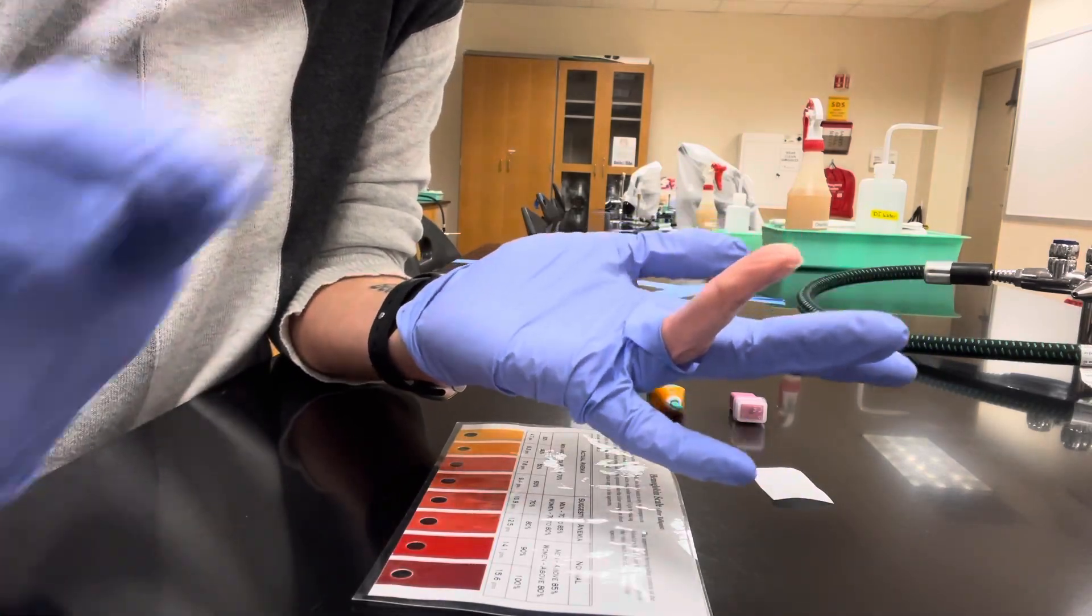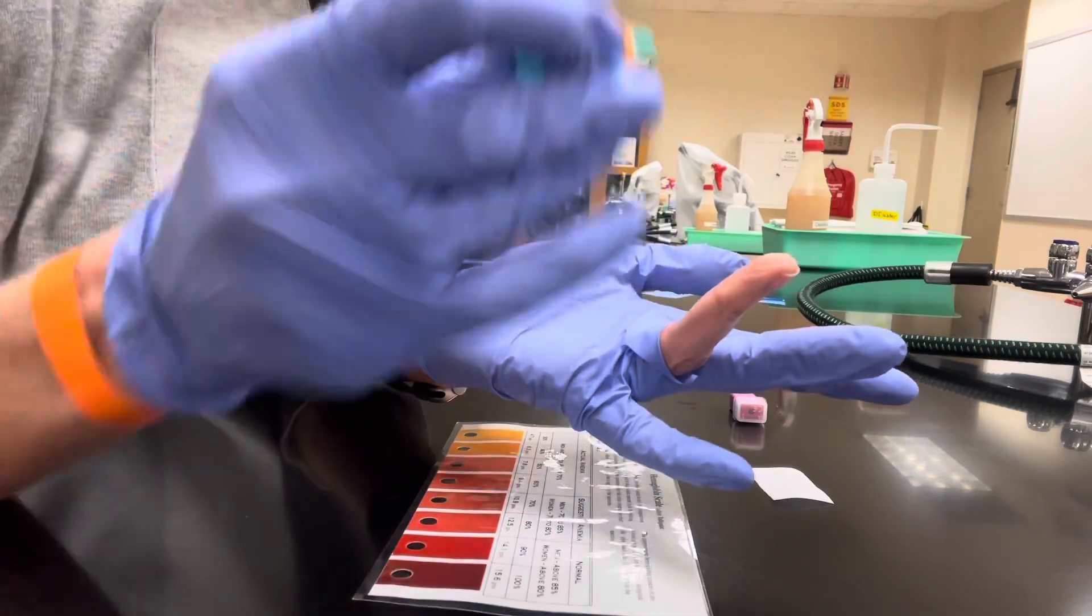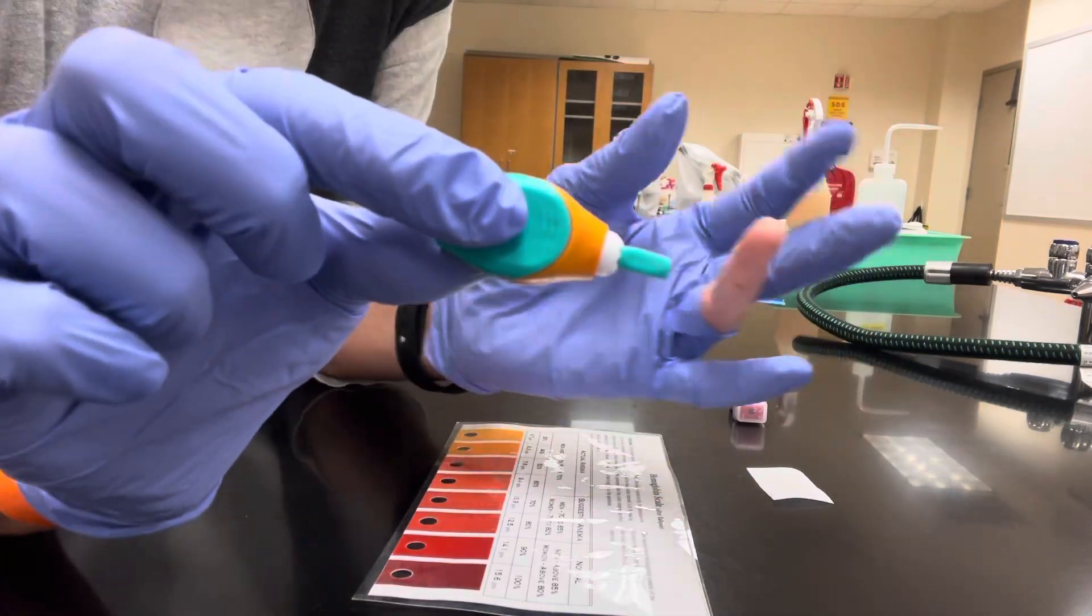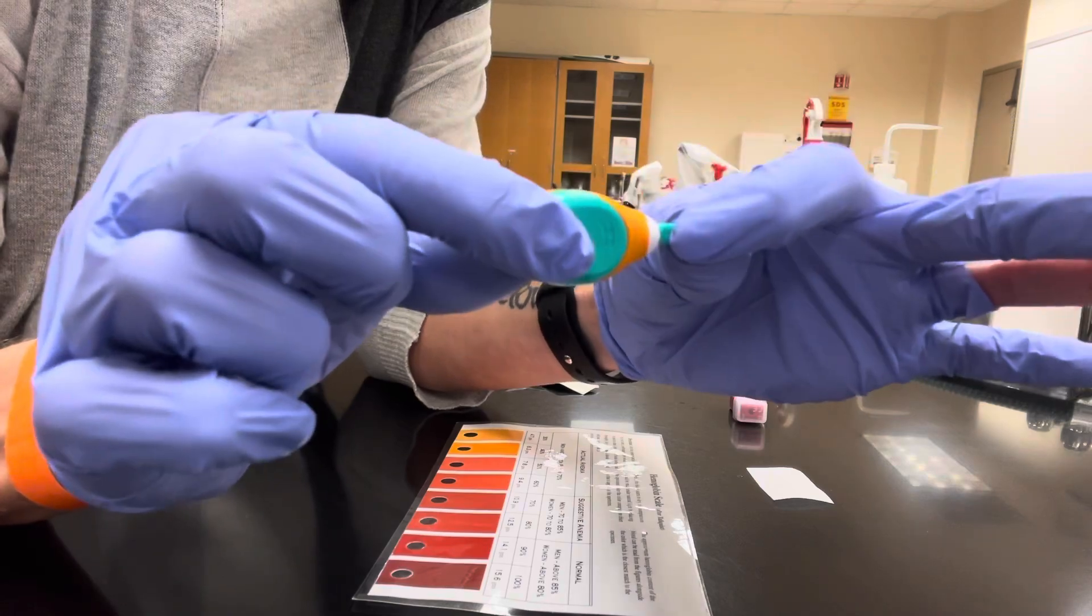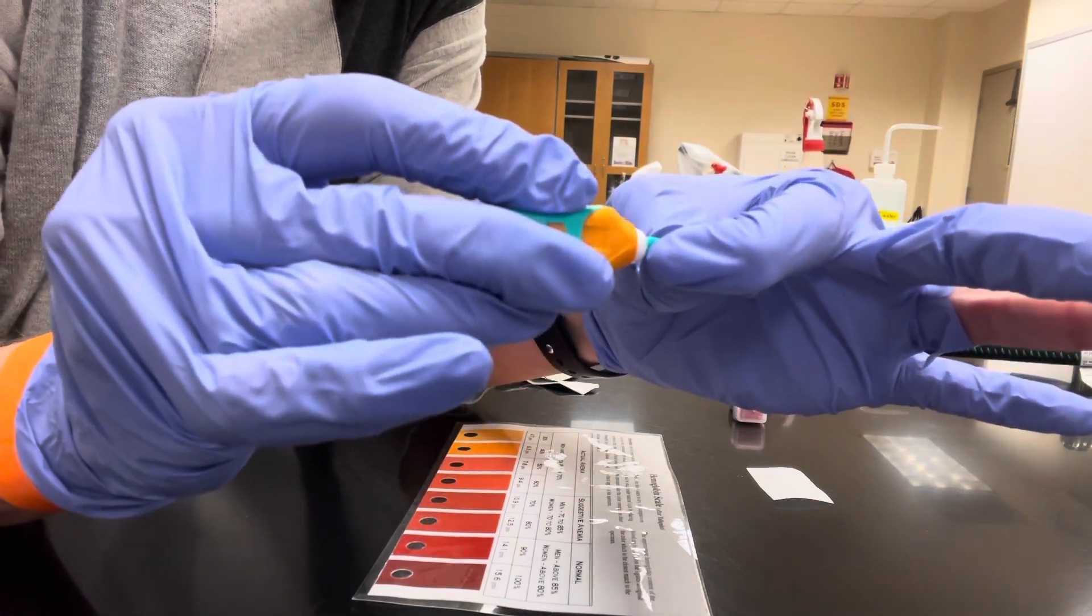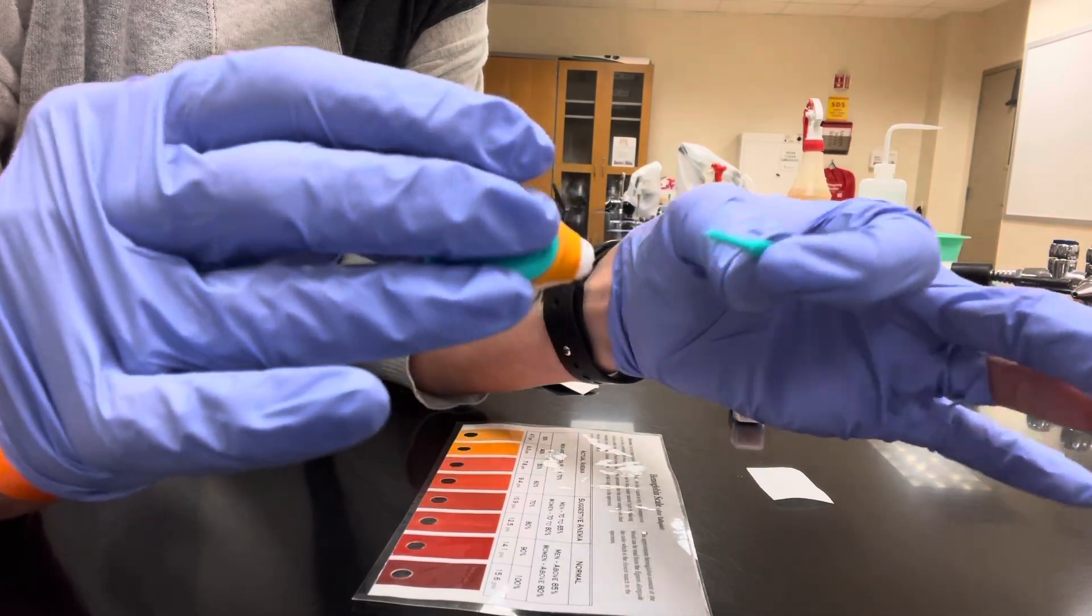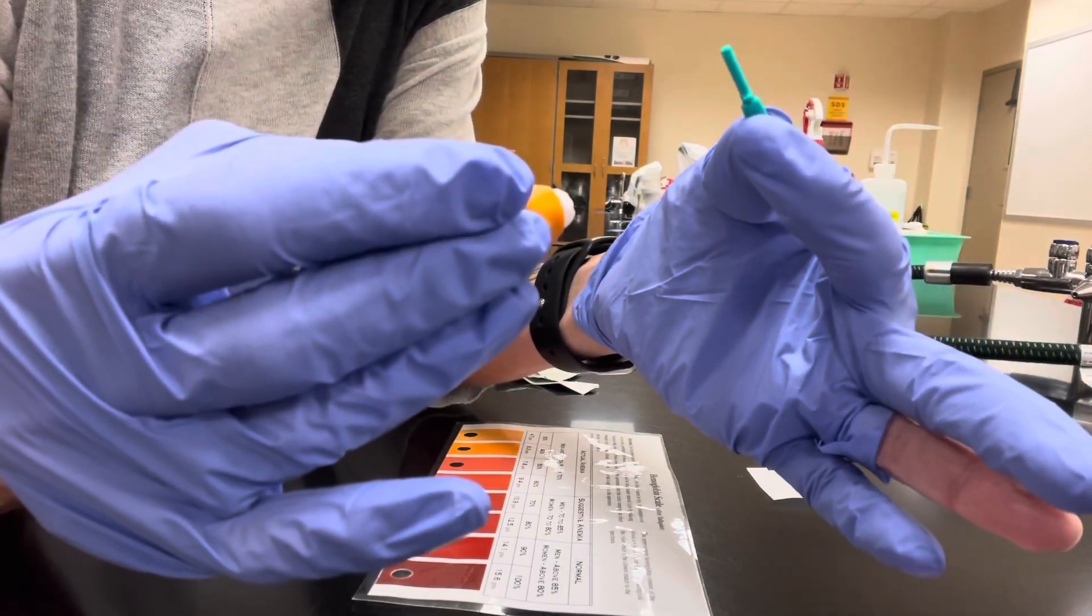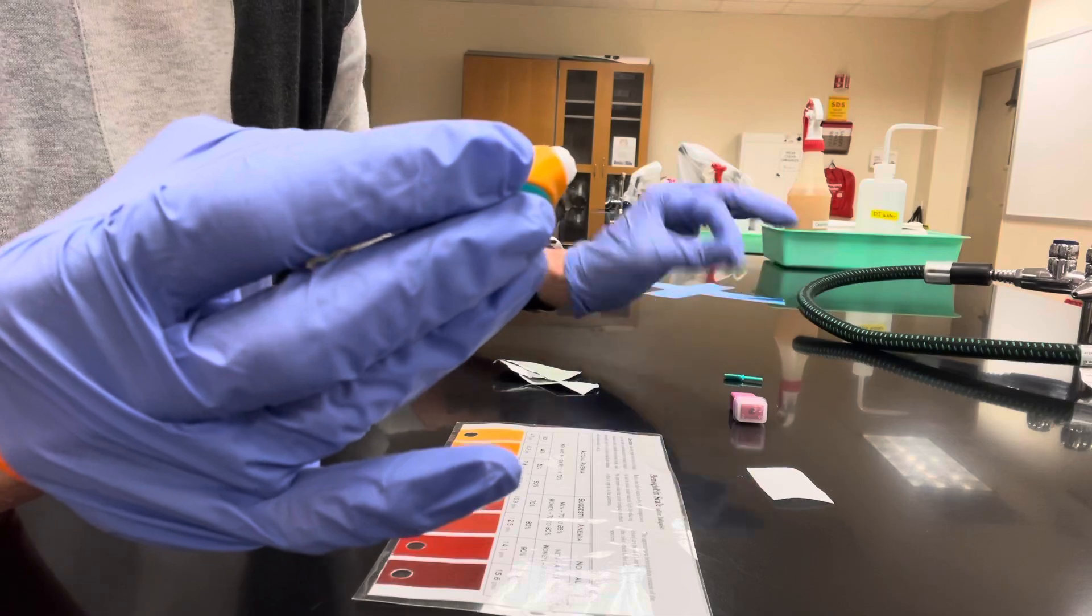Once it's air dry, then you take a lancet. If you're using one of these, you want to take the green cap and just gently twist until the green cap comes out. Place that aside.